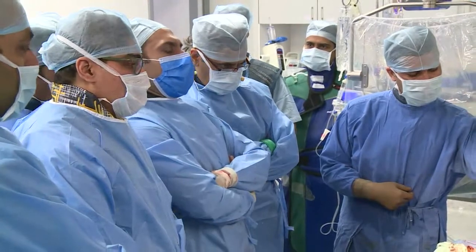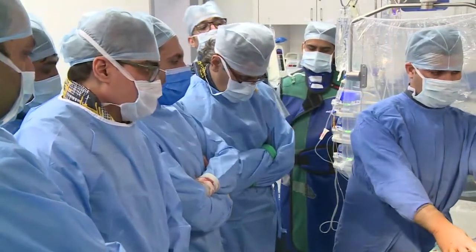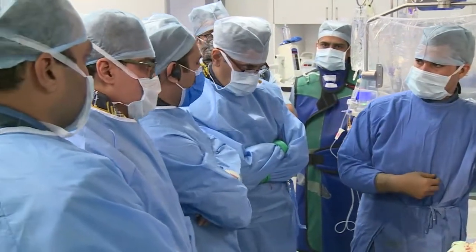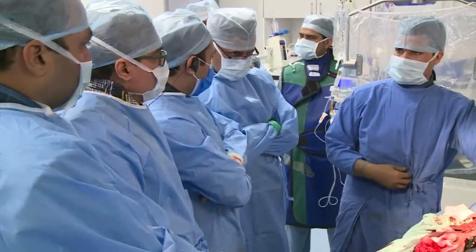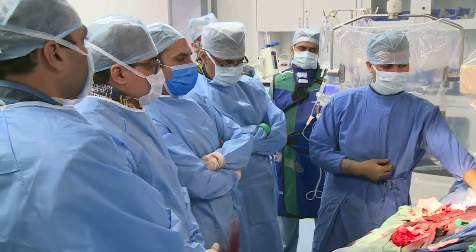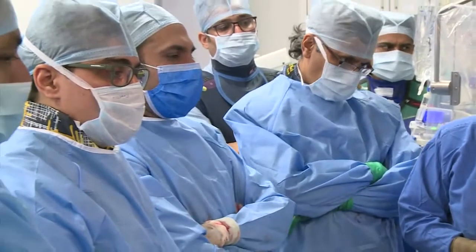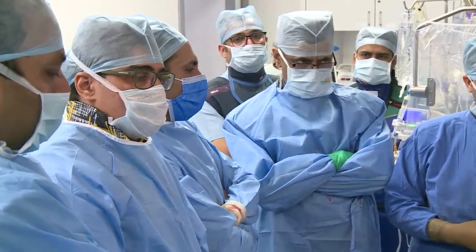For us, we have discharged them on the third day. For him, I want to send him home day after tomorrow because right now he's not on any support. We did not give him any GA. He does not have an endotracheal tube in place, and we don't have any problem with the valve deployment. There is no perivalvular leak, no complete heart block. So I think he's going to stay in ICU for one day. Tomorrow he's going to stay in room, walk around, and day after tomorrow he'll be home.